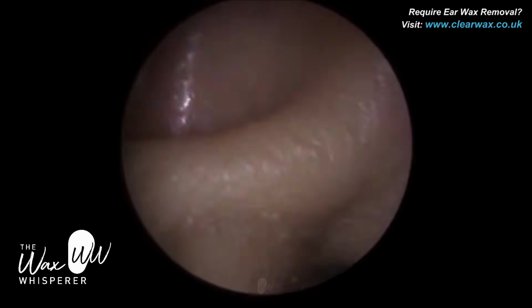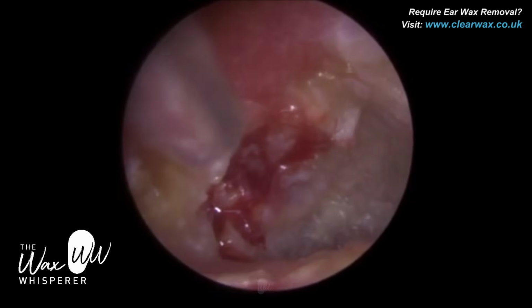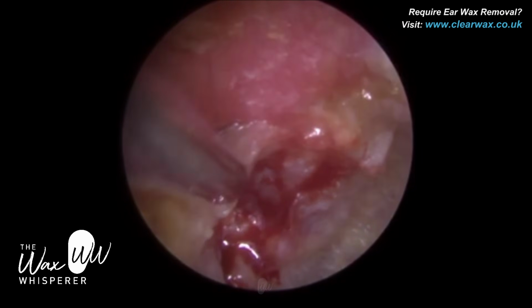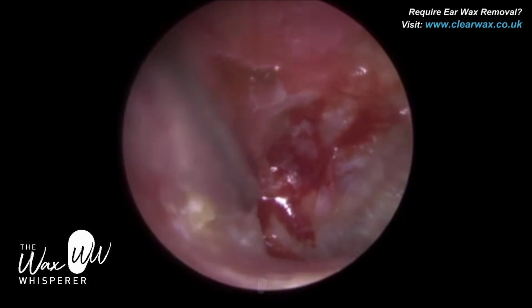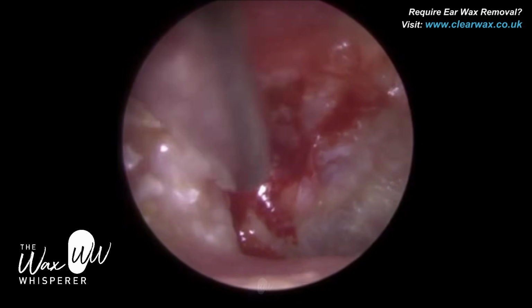And you can see some fresher layers of dead skin around there, the whiter layers, and it gets a bit more yellow. So the whiter layers are the fresher layer of dead skin. So that skin is trying to migrate off the eardrum out of the ear canal, but it's getting stuck in this retraction pocket, and this is a bit more yellow. So this is still dead skin, but it's been in there for a bit longer. It's oxidized.